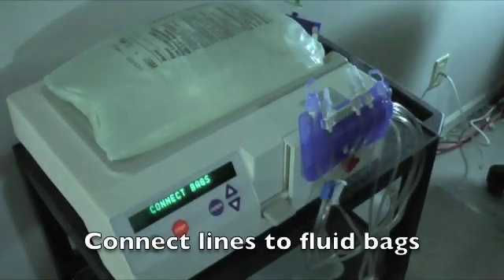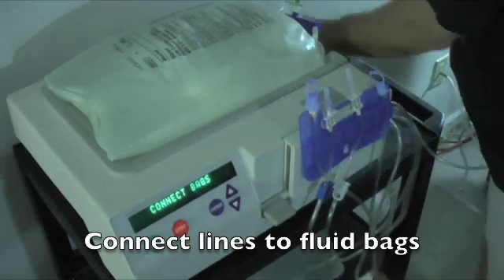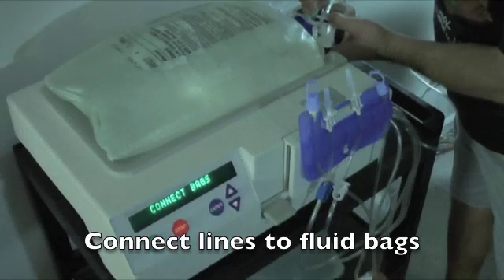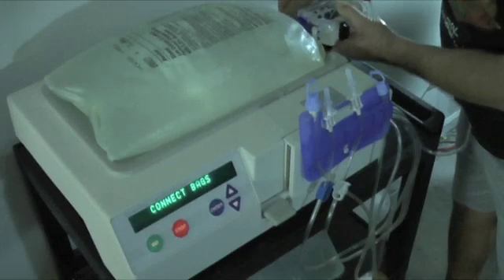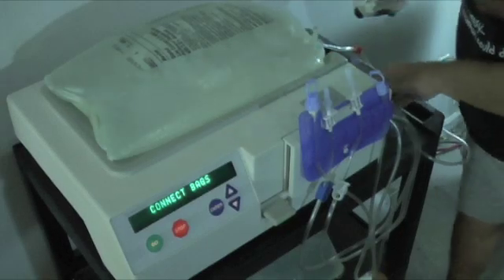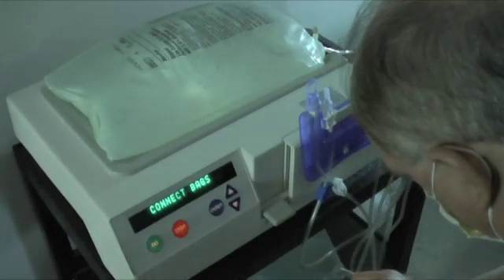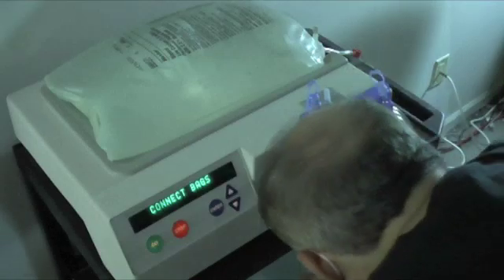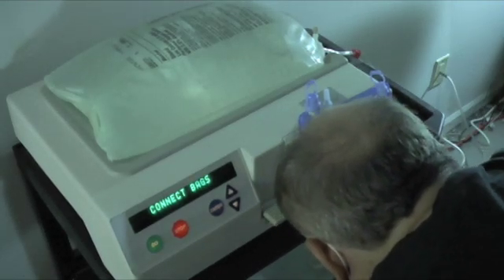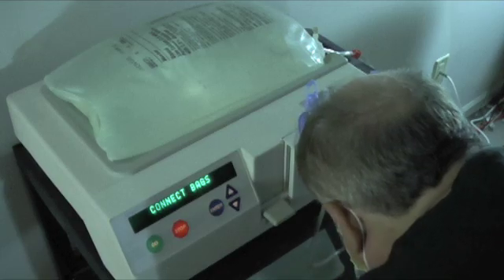The machine is still testing. Now the machine is ready for me to connect the lines to the bags — the bags are already clamped up. I connect the bags of fluid to the lines: first bag connected, now connecting the second bag. I am wearing my face mask, of course. Make sure you use proper antiseptic techniques as taught to you by your nurse.